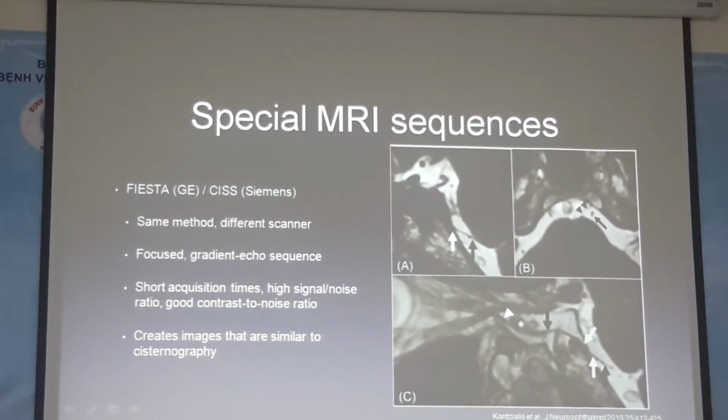And most of these images can be obtained without having to give the patient contrast through an IV.